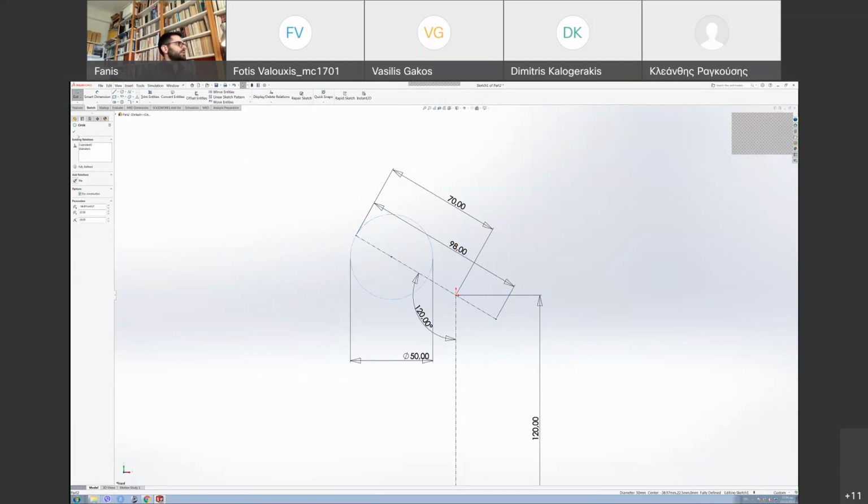Okay, so I'll also make this for construction. If you click for construction, it just makes it so you can't get a solid out of it. It's not a big deal.